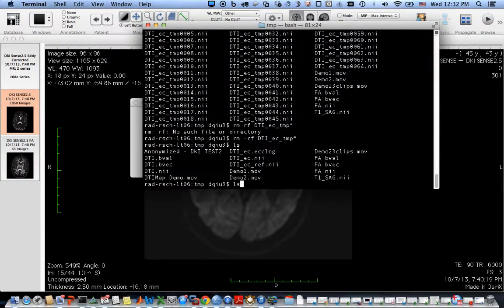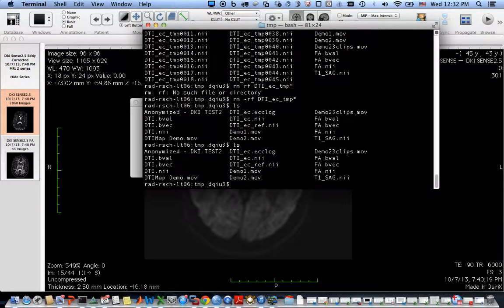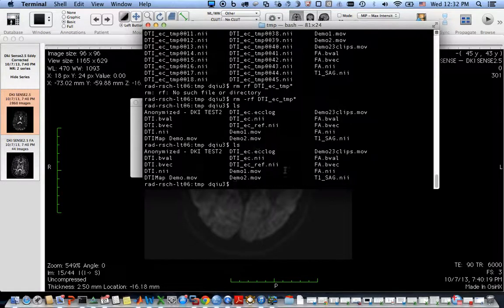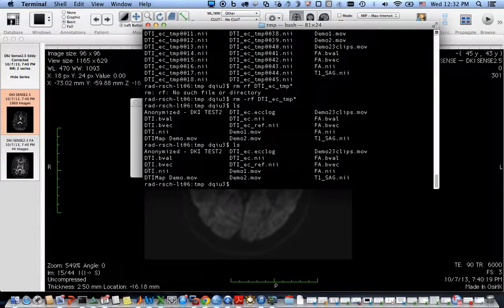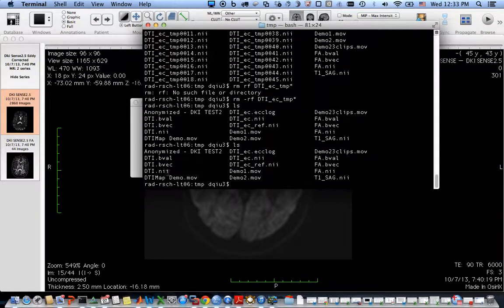Now you can do a list of all the files in this directory. You can see DTI.nii file that has just been created.